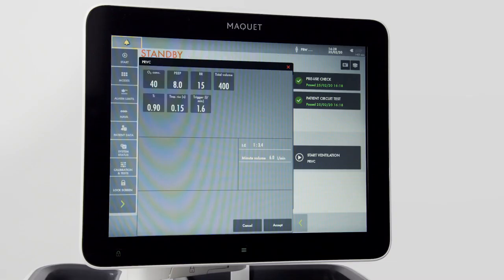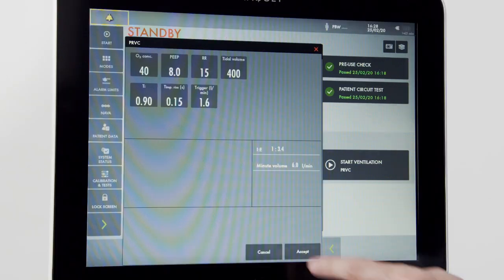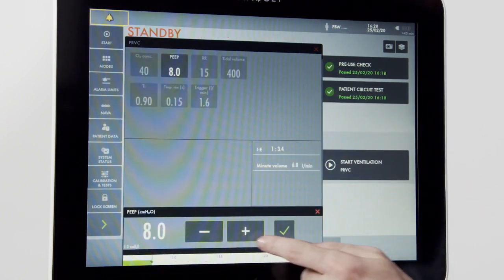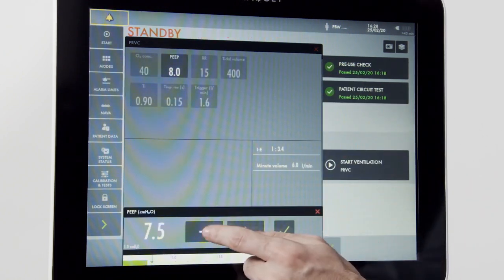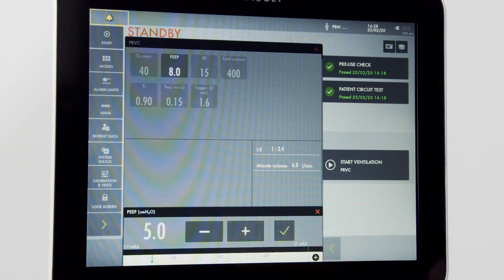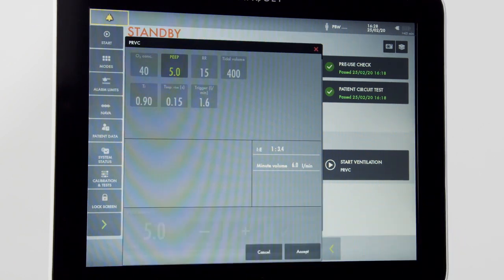On the mode screen, all of the settings available for the mode are in one place. To change a setting, simply press it. A window on the bottom will appear and you can make your adjustment up or down. Once you've adjusted it to the setting desired, press the green check mark to accept the setting change.